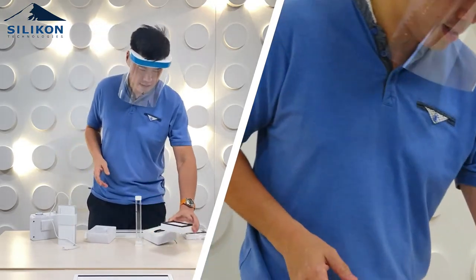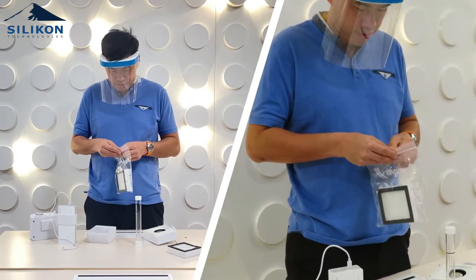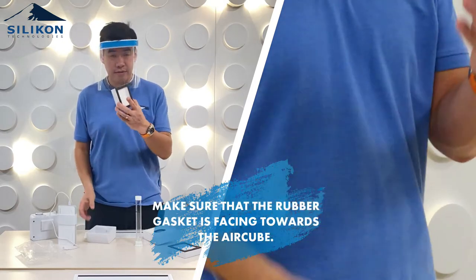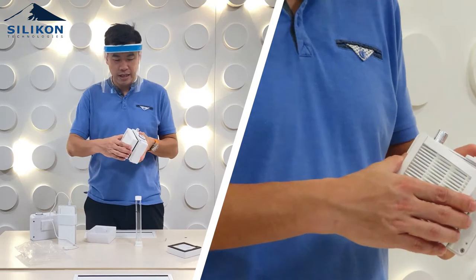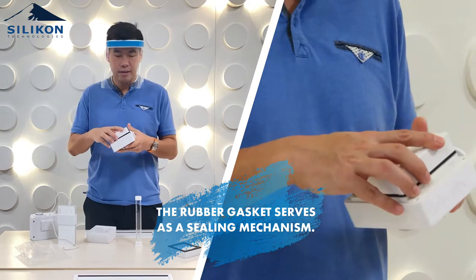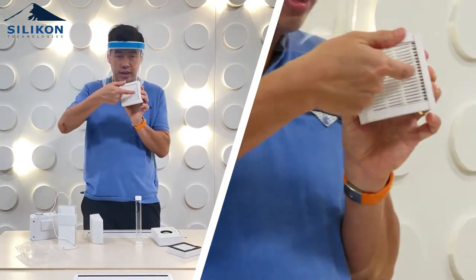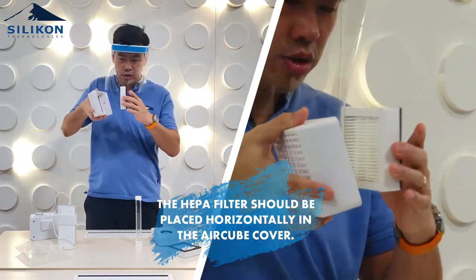The first thing you have to do is make sure there is a rubber gasket here. You have to make sure the rubber gasket is facing towards your air cube, because the rubber gasket serves as a sealing mechanism for the blower pump. The lines on the HEPA filter have to be horizontal, so you just connect it this way.